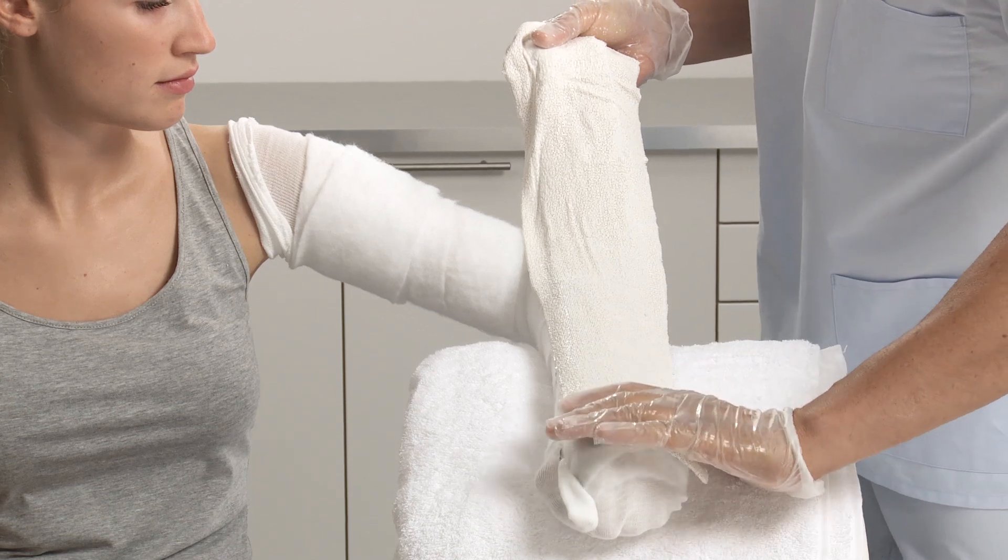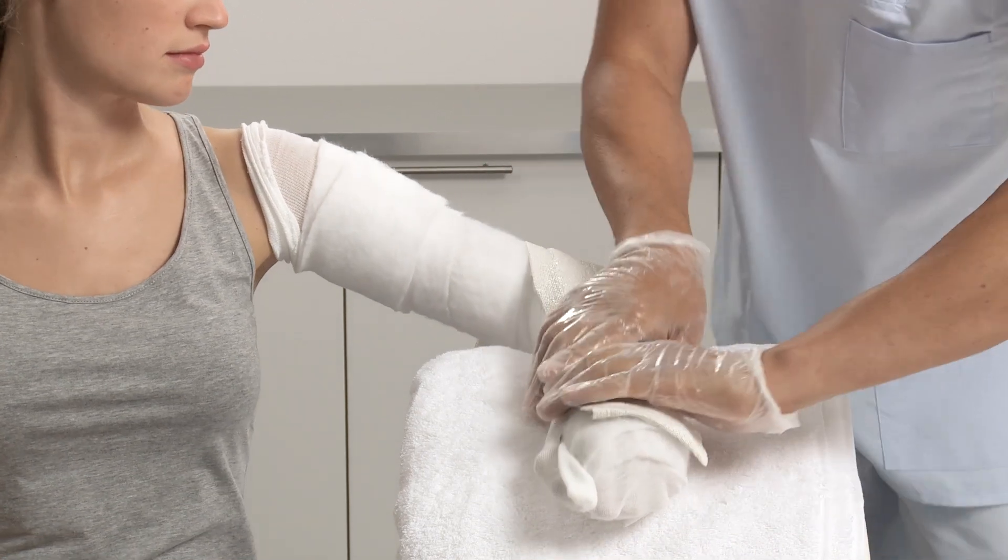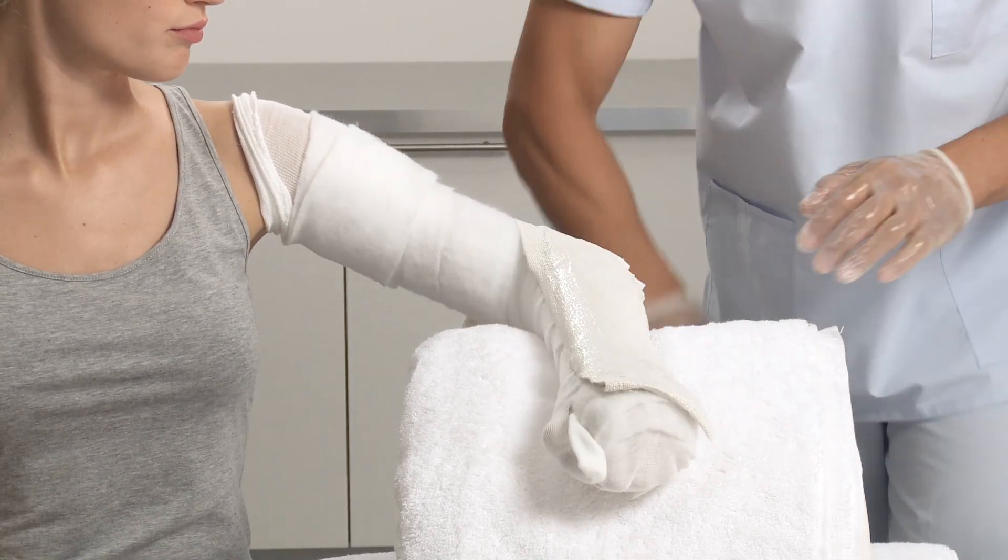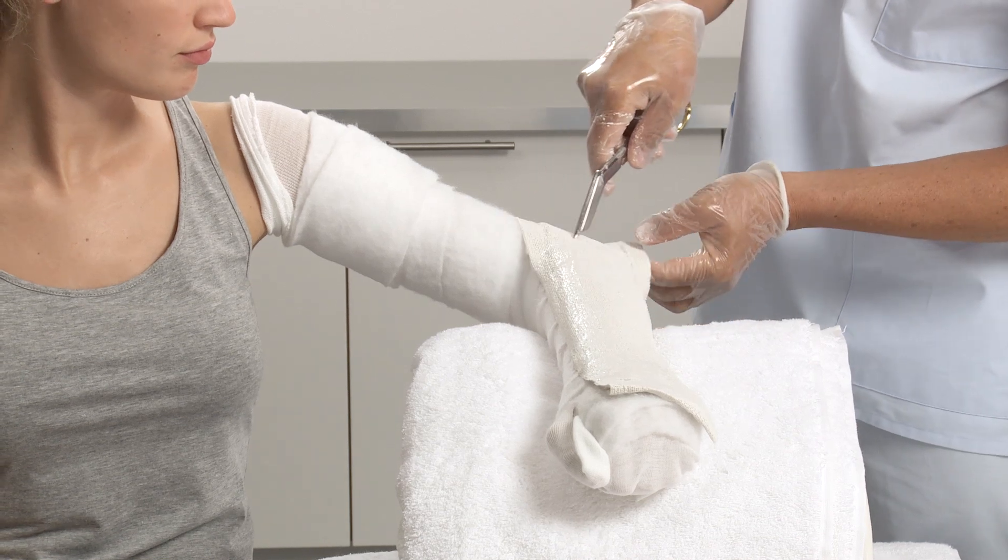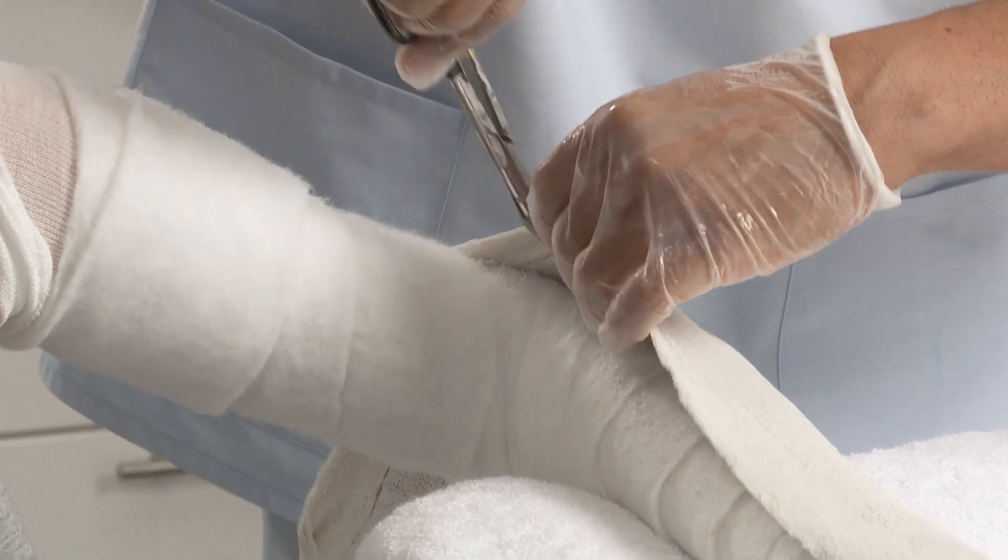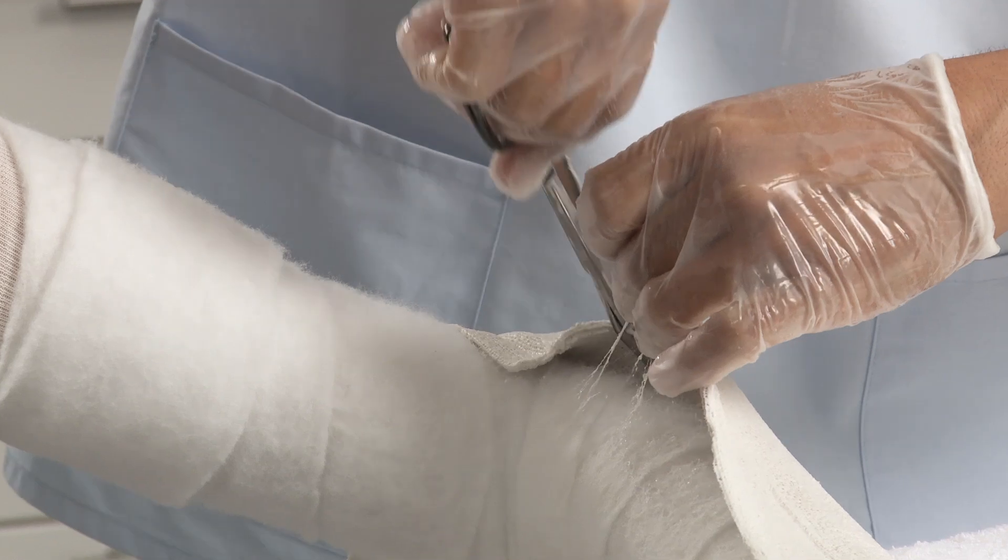Prepare a second splint as before. Apply the first splint onto the patient's lower arm and gently smooth down. Cut away any surplus splint.